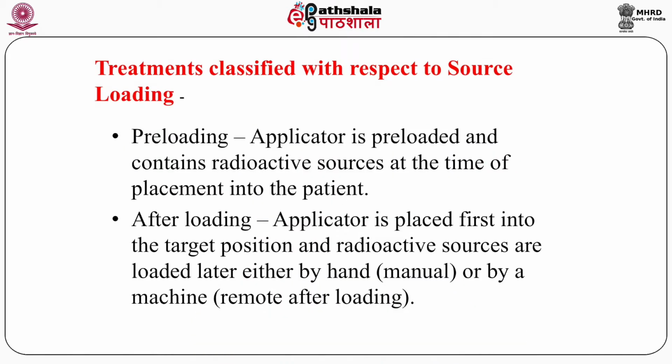Now a further classification of brachytherapy is on the basis of source loading. In olden days it was preloading. The applicator is preloaded and contains radioactive sources at the time of placement into the patient. In this case, the person loading the radioactive sources gets very high doses, and nowadays it is not used in practice.